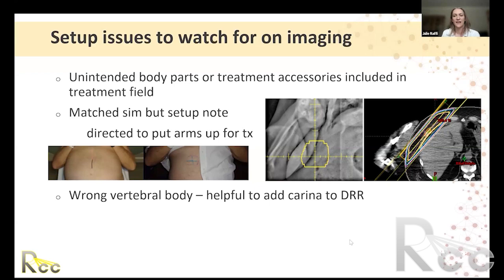So again, making sure that everything is communicated properly from simulation to planning to treatment. In this case, something changed in the planning process. They wanted to change the arm position, but that wasn't clearly communicated to the therapist.